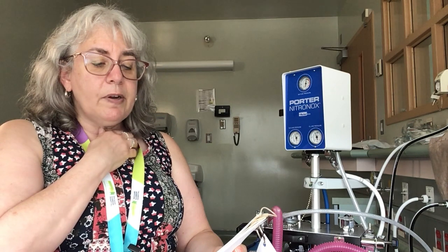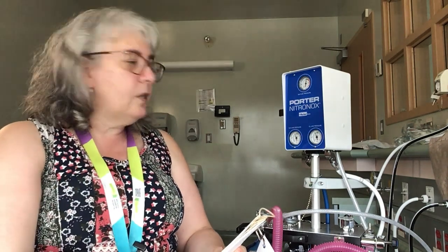Okay, we're also going to perform vitals on the patients and obviously fetal health surveillance prior to use, and blood pressure, pulse, O2 saturation every 30 minutes. So it does not require continuous oxygen saturation unless the patient's status has changed, in which case vitals and any other kind of assessment will be done more frequently.